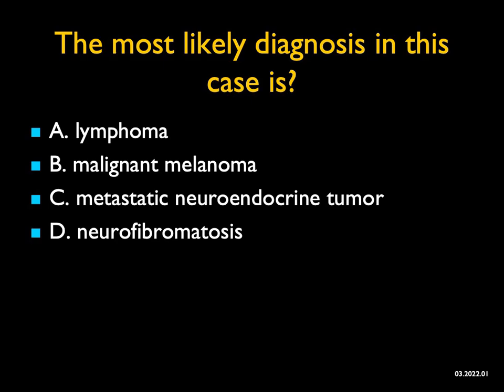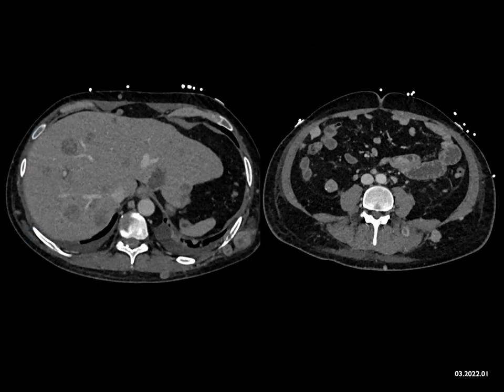The most likely diagnosis in this case is — the thing about this case is look how many lesions you can see. You see pleural effusions and looks like pleural implants in the left chest. You see multiple liver lesions. You see implants on the image on your right in the subcutaneous tissue. There are also lesions in the patient's small bowel, looks like his jejunum. There's periadenopathy. So what are we dealing with? We're dealing with a disease which involves multiple organs and organ systems.